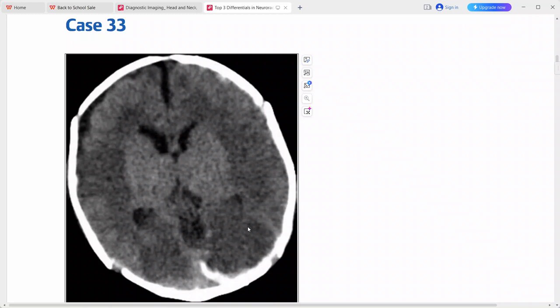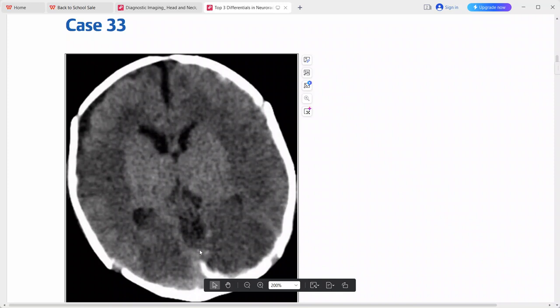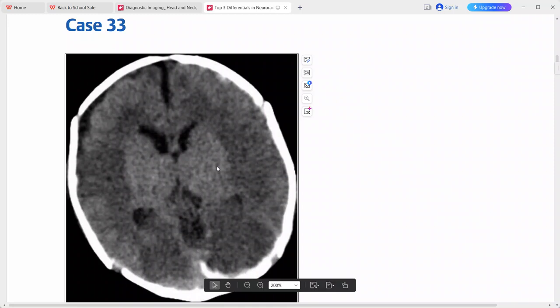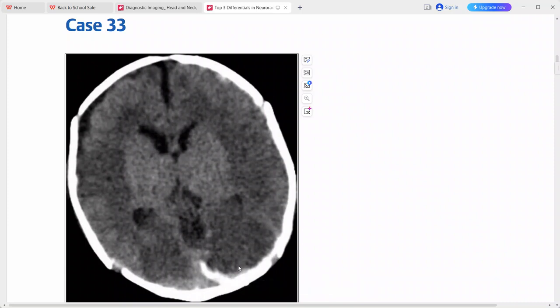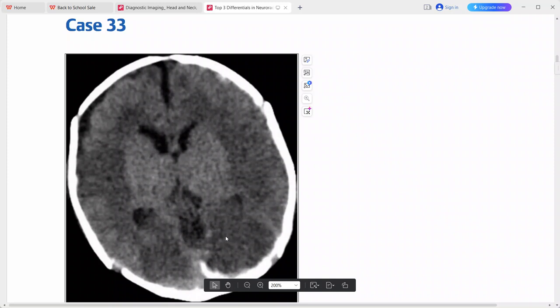Considering this imaging picture of diffuse cerebral edema in an infant, the top diagnosis would normally be hypoxic ischemic encephalopathy. However, the subdural hematoma changes the diagnosis altogether — you should consider non-accidental trauma as your top differential whenever you find a subdural hematoma in an infant without a typical trauma history.